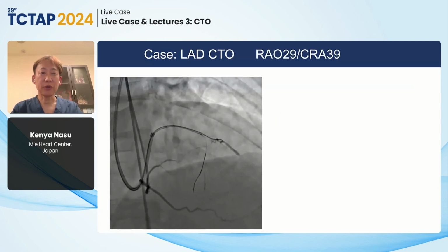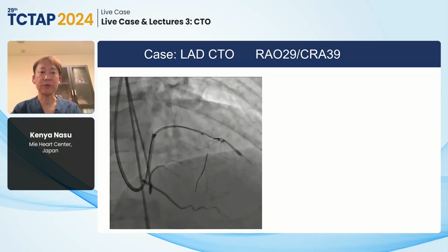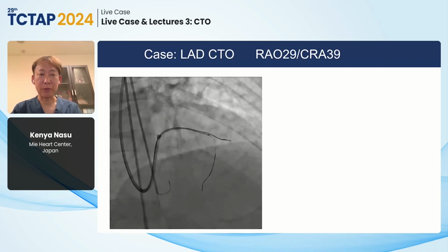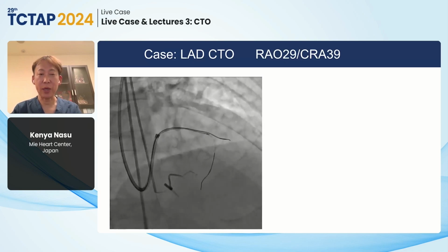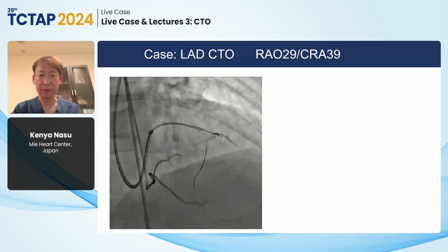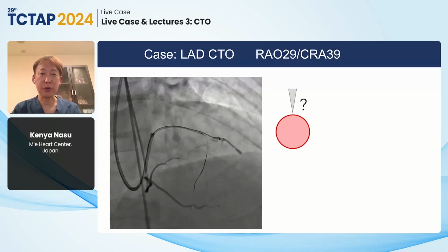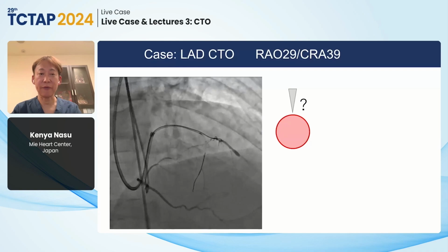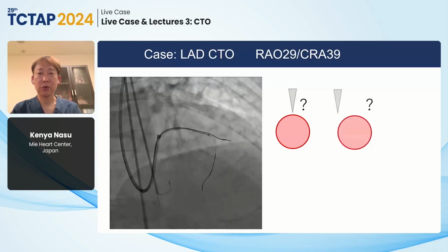After confirmation of the proximal cap with IVUS guidance, my guide wire, Gaia Next 4, is advanced gradually. You can see my wire tip has almost touched the cap. However, from the AP cranial view only, we cannot confirm the real wire position because the angiographic view is two-dimensional.